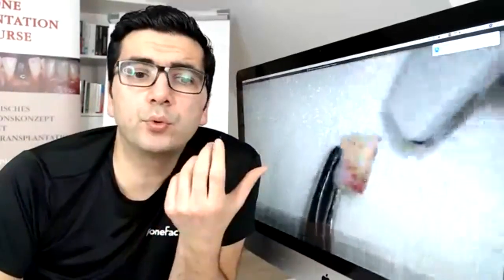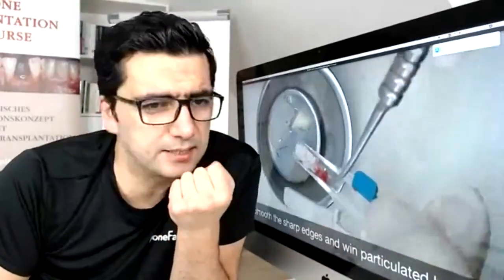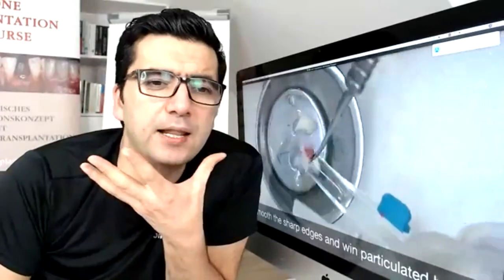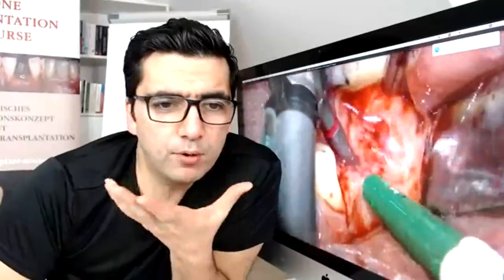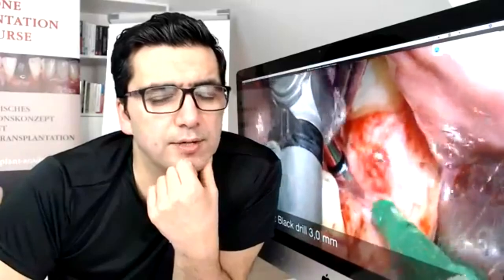Not only is reducing bone thickness important — we also want to gain particulate bone, because this is our goal. This is vital, red, living, real autogenous bone. When we collect this bone during the procedure, it is like gold to us — in fact, more valuable than gold. The next step is implant preparation.